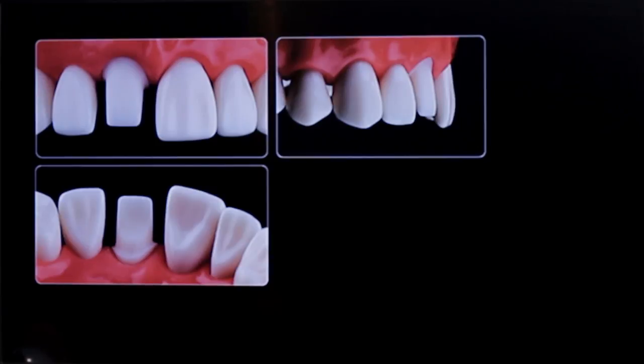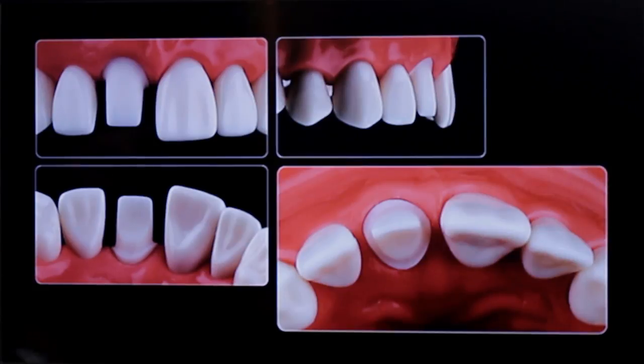Once you're through with the entire preparation, this is how the final preparation should look. From the labial view, you have a wonderful equigingival margin that is uniform in width with a good taper from the cervical through to the incisal edge. From the palatal surface, I prefer to keep the margin slightly supragingival to conserve tooth structure at the neck — the weakest area — especially in patients with traumatic bites or root canal-treated teeth. From the proximal view, you can appreciate uniform plane one and plane two reduction. Inadequate plane two reduction may cause the incisal edge to appear to jump forward, violating the neutral zone. From the incisal view, you should be able to see all 360 degrees of the margin, confirming no undercuts, with the incisal edge relatively along the arch perimeter.